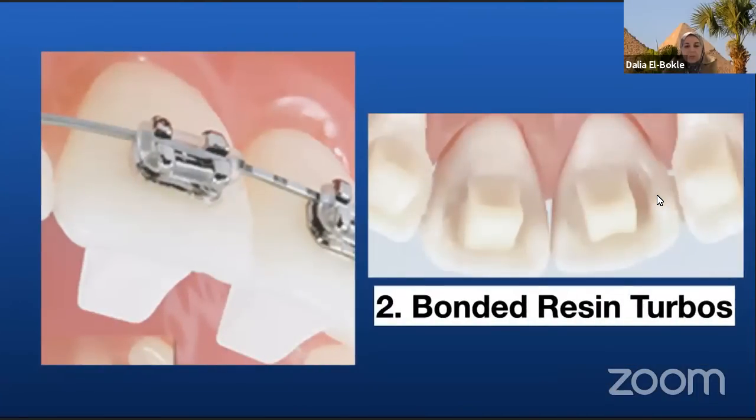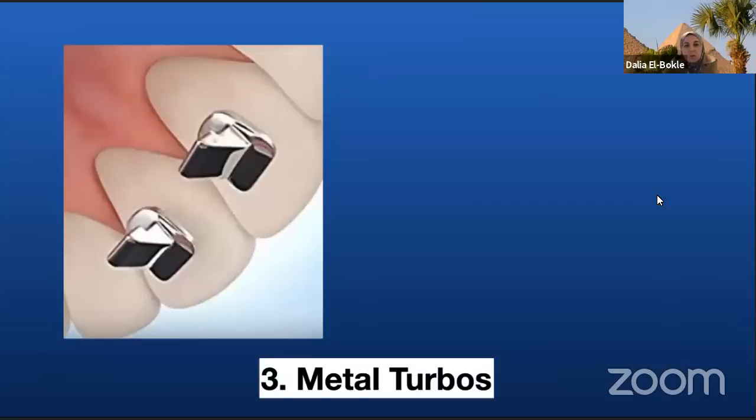Another type of the anterior bite turbo is the bonded resin turbos, as you can see in this diagram. Or you can use the bonded metallic turbos that you can buy and bond just like you bond the brackets. But these have been associated with a high incidence of breakage, and they are difficult to adjust, unlike a bite turbo made of composite or glass ionomer.